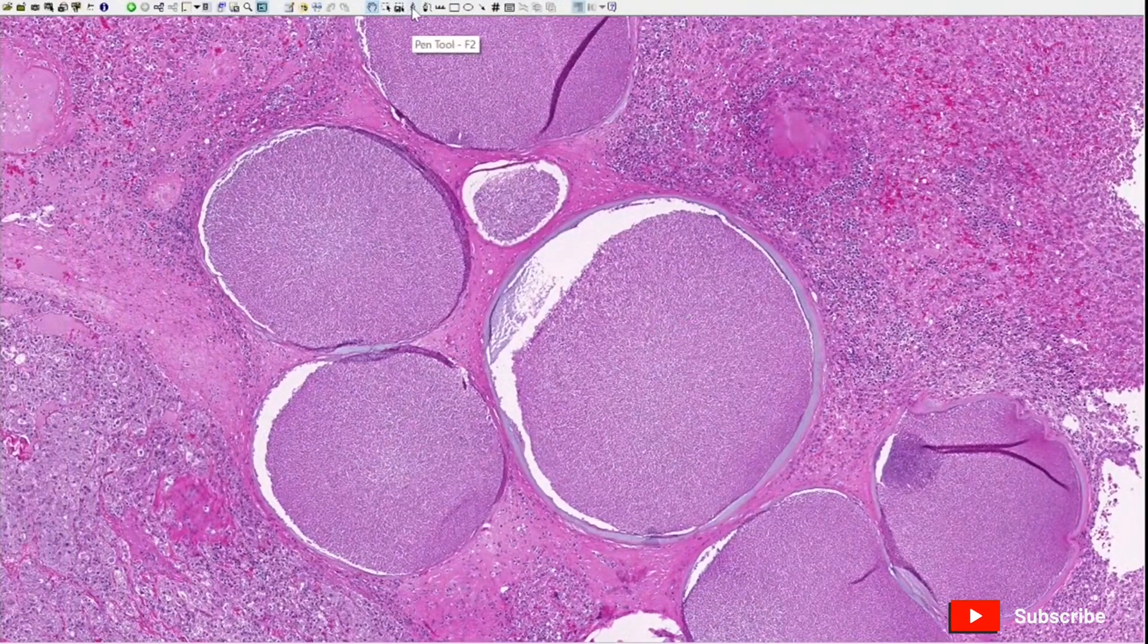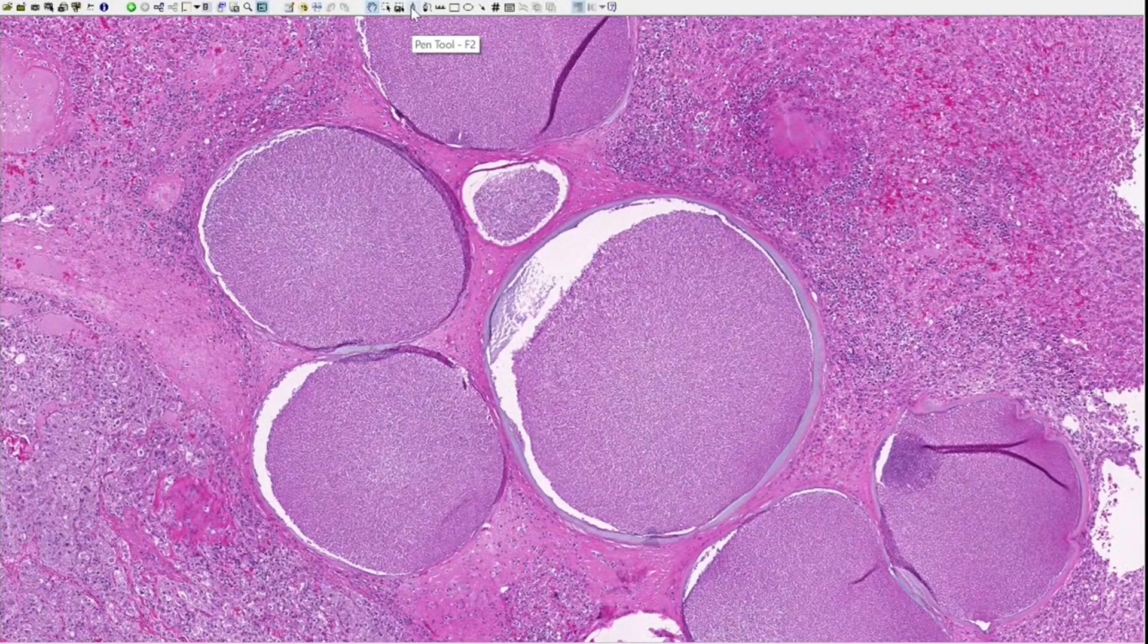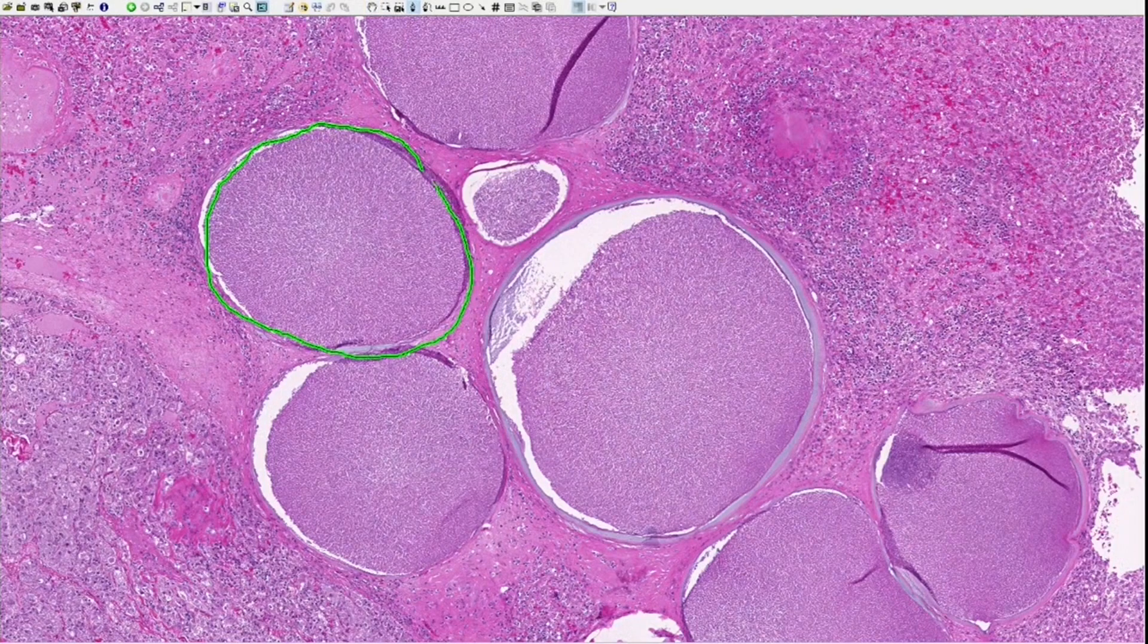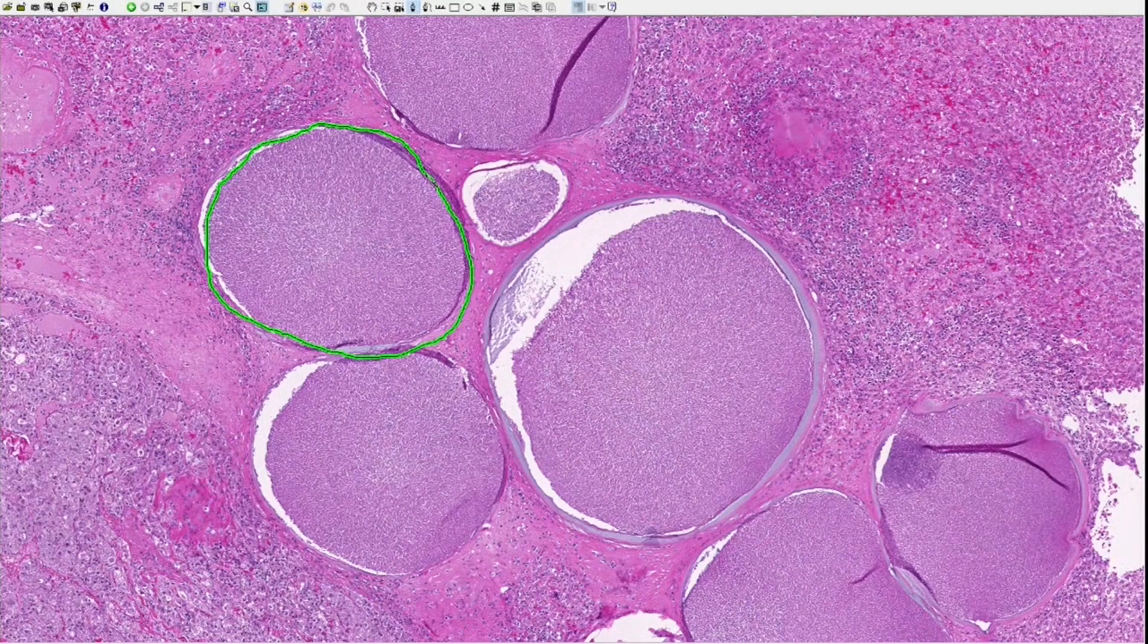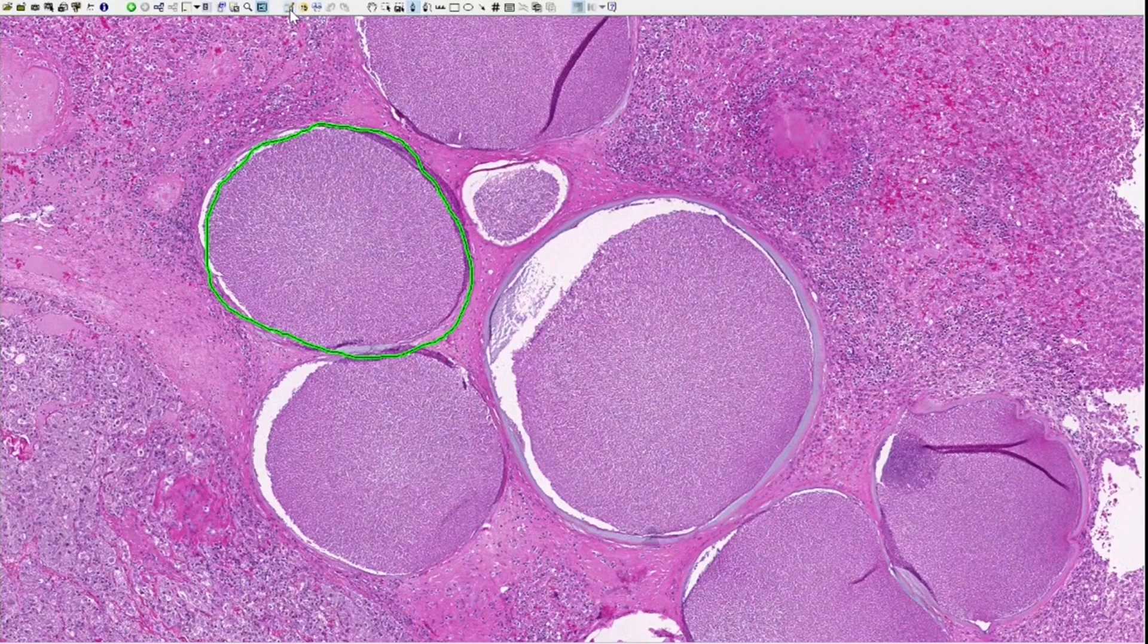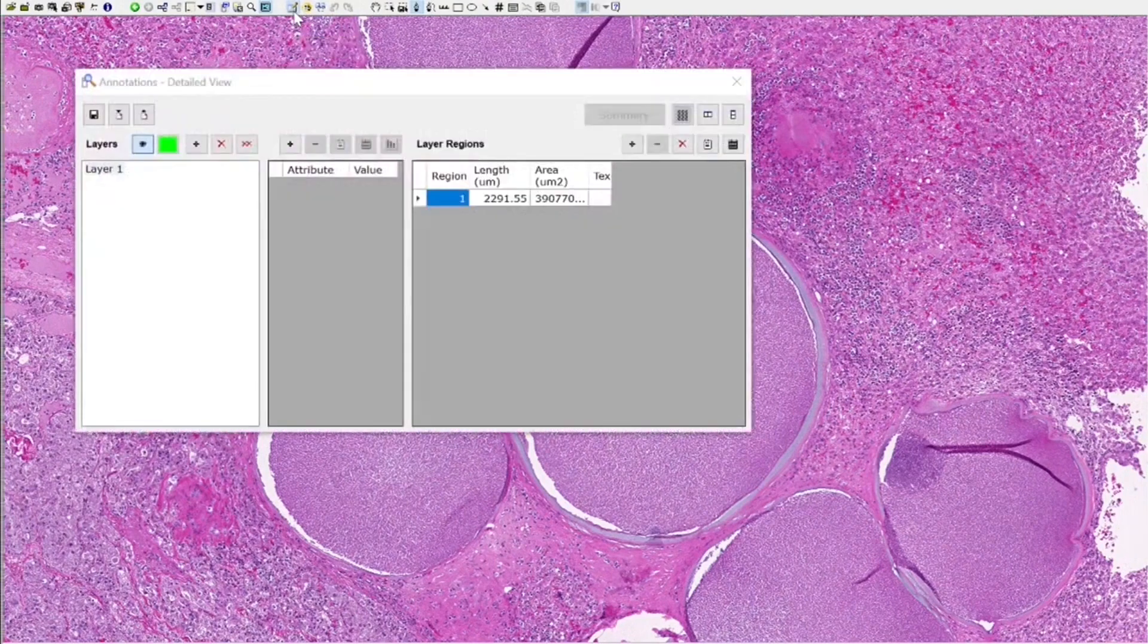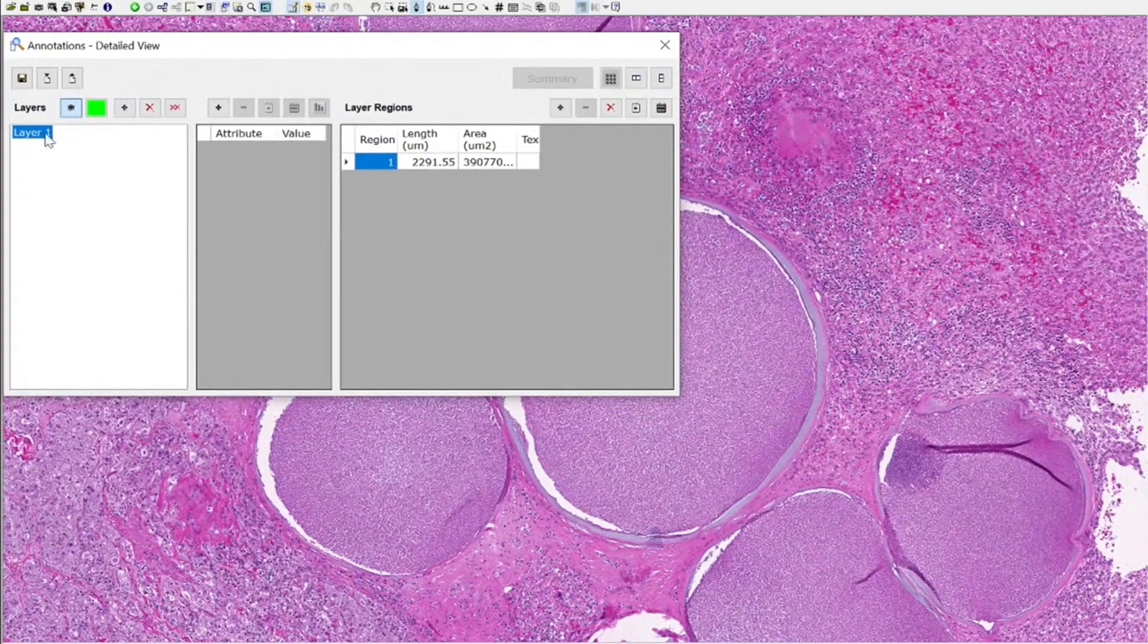Our annotation tool is the pen tool, and you can see the shortcut as well. I'm going to click on one and I'm going to annotate the parasitophorous vacuoles, just a cross annotation. You can see that it becomes green. When you want to see exactly what color and what class you're annotating, you click on the annotations window. It appears in the new window, so if you have two monitors it's going to be very handy.